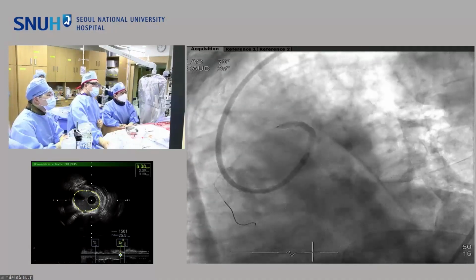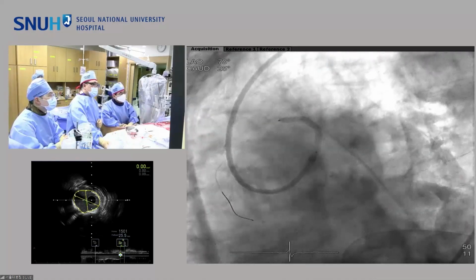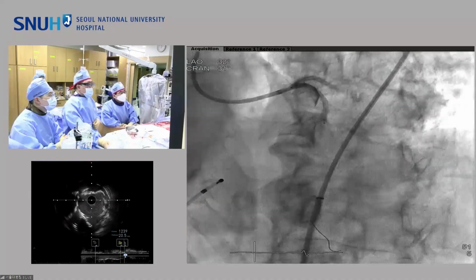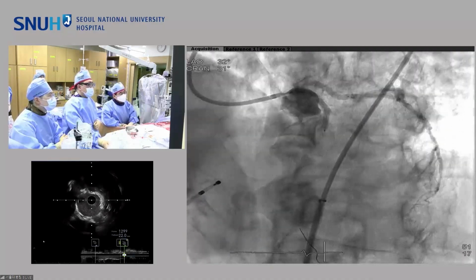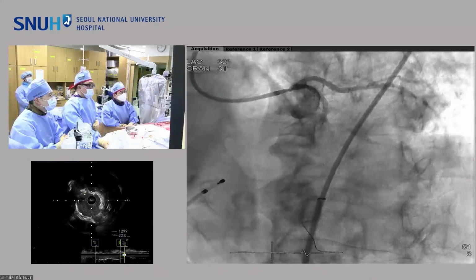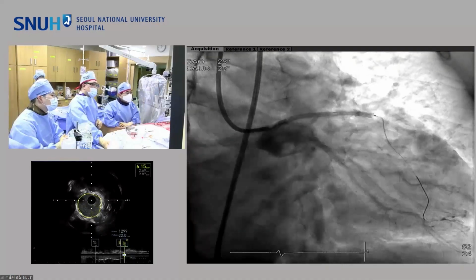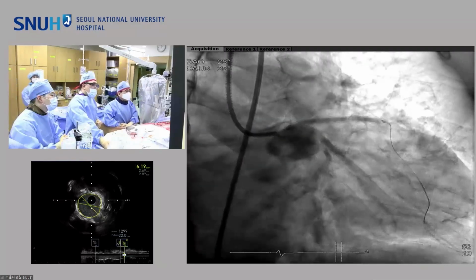My practice is always I check the indentation of the inflated stent. I always try to keep inflation time up to 40 seconds to make the inflation reach the nominal diameter. If you inflate the stent balloon just 10 seconds, it does not reach nominal diameter. There is not significant indentation, but there is some undulation because of the calcified proximal LAD segment.